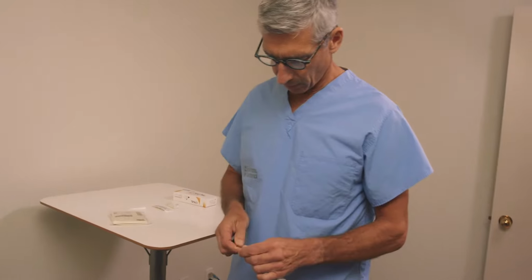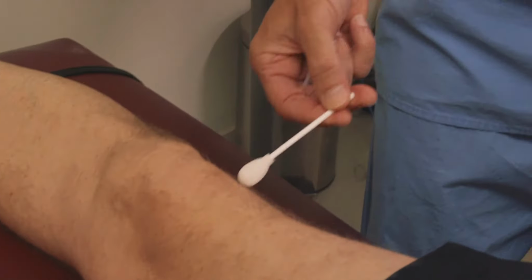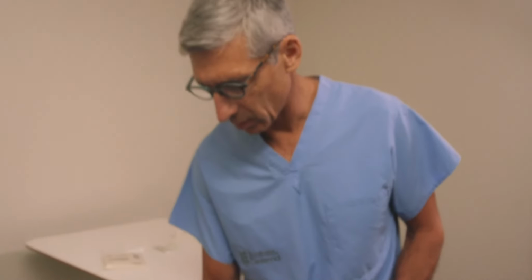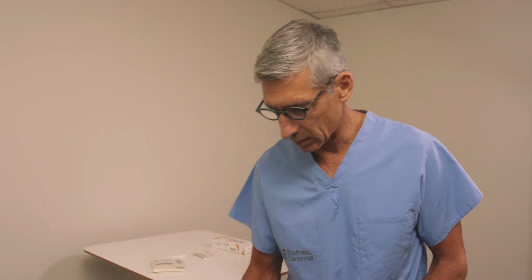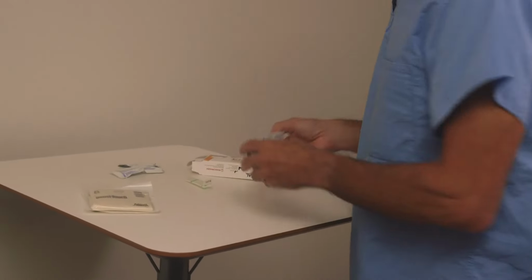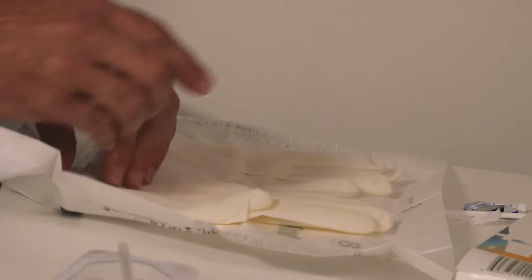We'll begin by prepping the area with the chlorhexidine prep stick. And we'll start in the area of the injection, which will be right here. We'll prep 10 centimeters medial, superior, inferior, and lateral to the area of the injection. Make sure you completely cover the area. And it's always a good idea to let the prep solution dry a little bit, removing the syringe from the package and carefully aseptically removing the lid. Then donning a pair of sterile gloves.